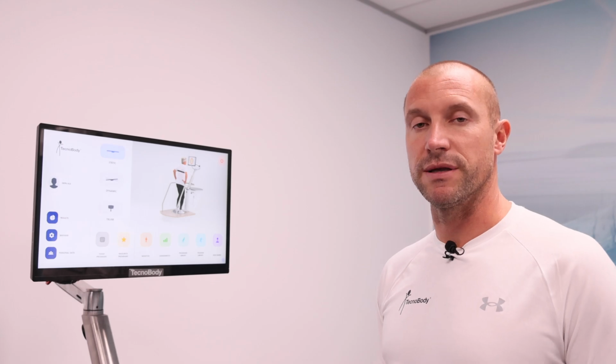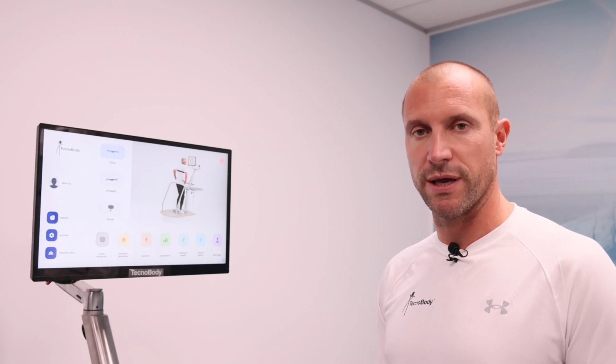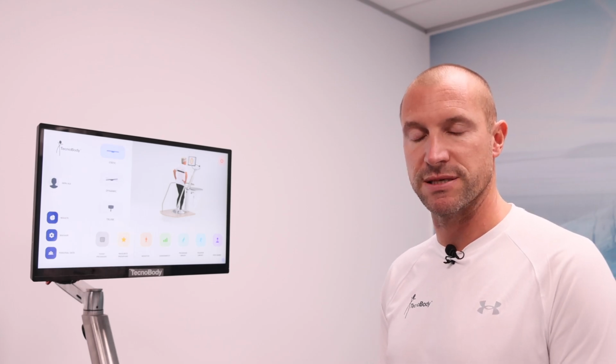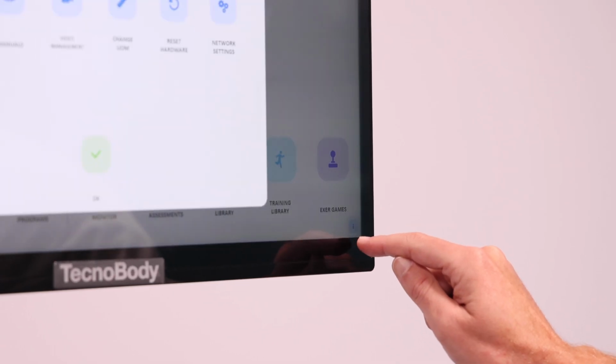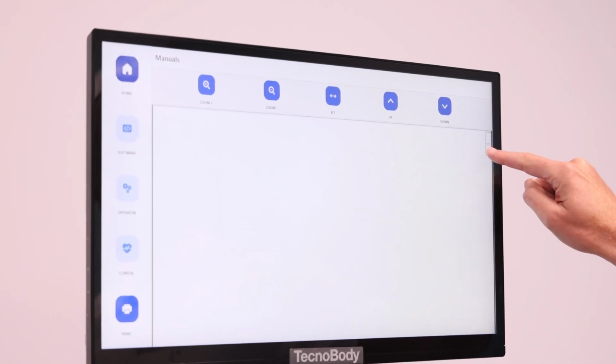These are the 3 main features of the ProKin with the assessment, training and exer games. Anyway, you can refer to the clinical manual to get more details and more information, just clicking on the I button.